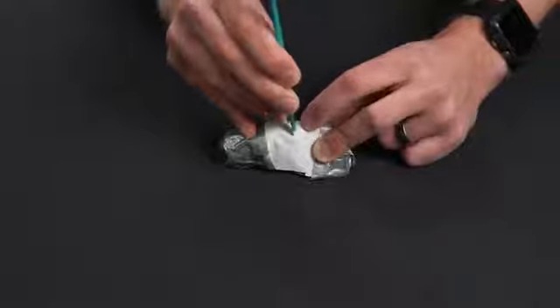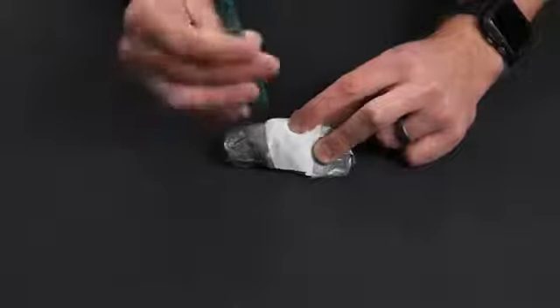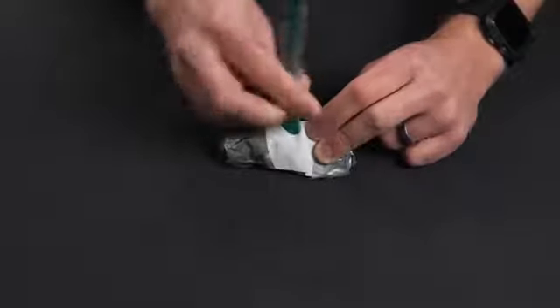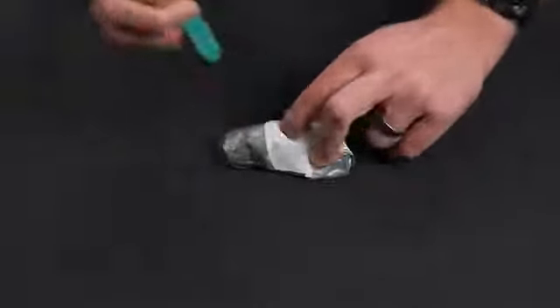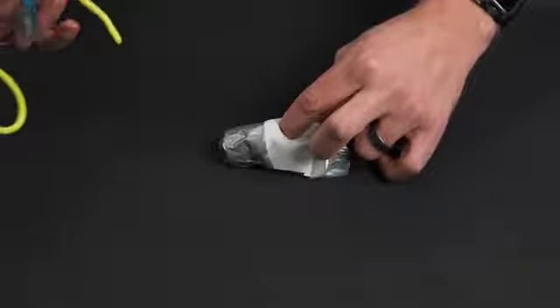We're then going to take the scalpel out, and you can either blunt dissect with your finger or take the opposite end of the scalpel and make the hole slightly bigger. Insert your finger to the side. Once again, we're palpating those tracheal rings.